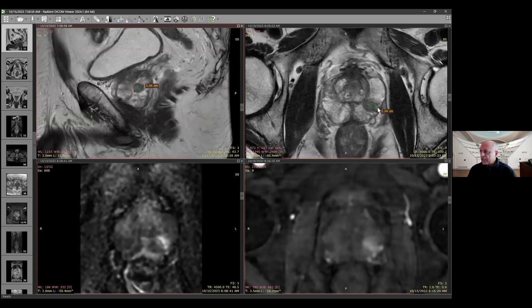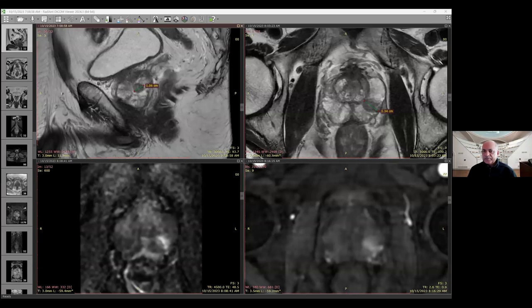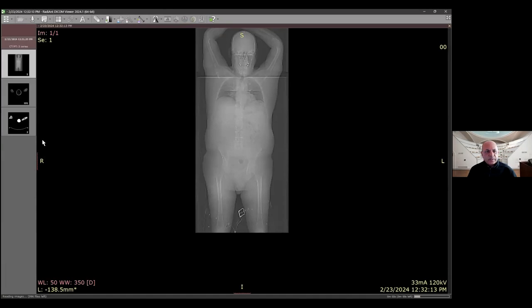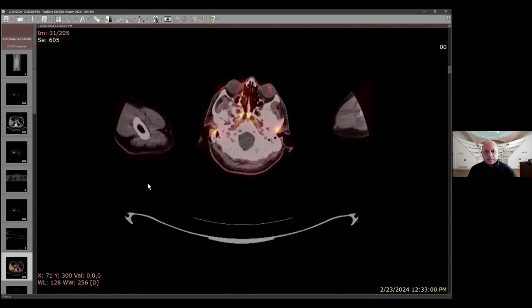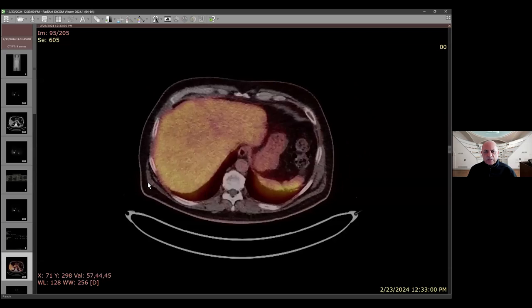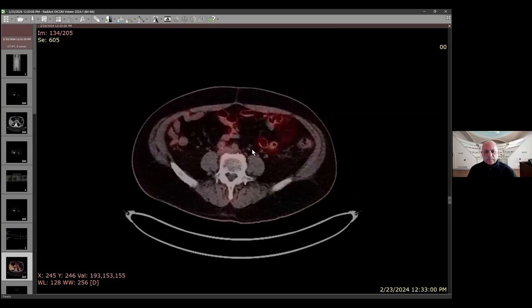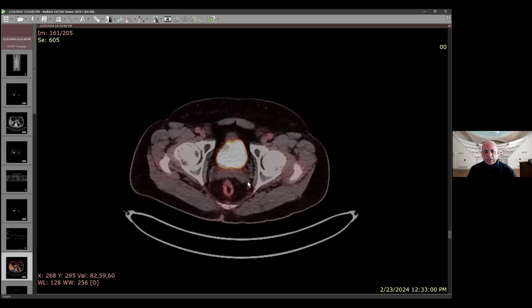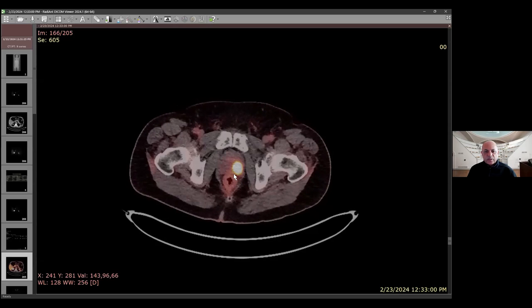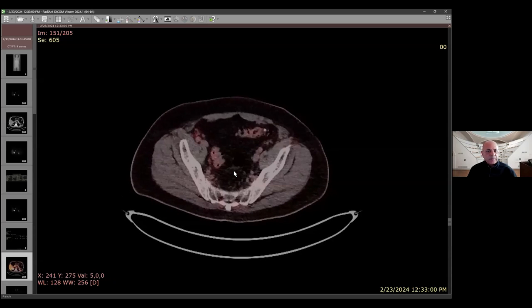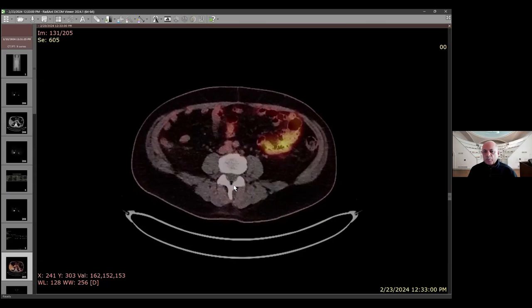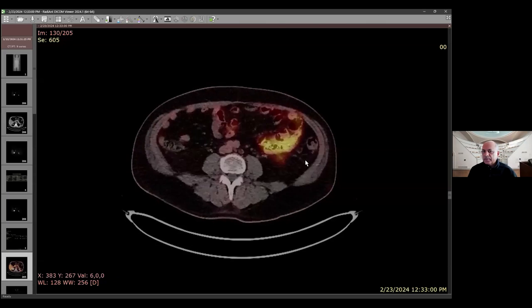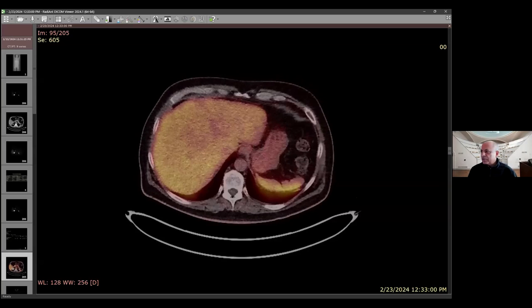This was targeted and came back as a grade group four — a Gleason 4 plus 4 lesion. That put the patient in a high-risk category for metastasis, so he ended up getting a PSMA scan. On the PSMA scan fusion images, scrolling through, there is no abnormal uptake in the bones or lymph nodes — the ureters show typical excretion — and that lesion does show increased PSMA uptake with nothing beyond the gland in terms of metastasis. That's how he was staged and appropriately treated.